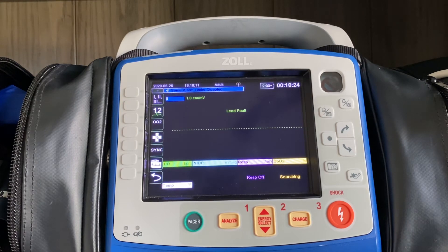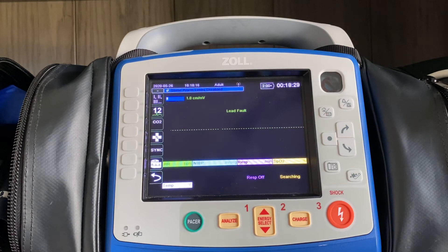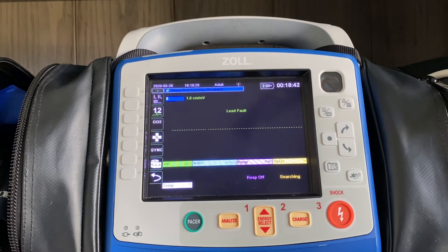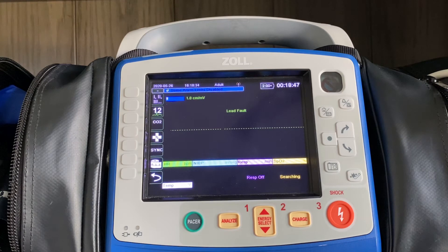An asthmatic patient, for example, is going to present a shark fin-shaped waveform. Your goal would be nice, flat, plateaued waveforms on the screen showing a proper respiratory cycle. If I see that shark fin-shaped waveform, I can say to myself, that's an asthmatic patient — I know what to do to treat an asthmatic patient and then see how they react to that treatment accordingly.